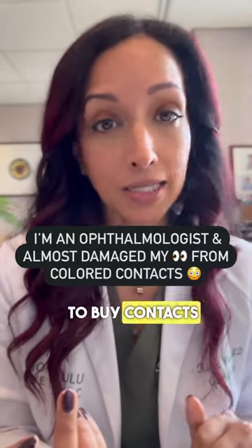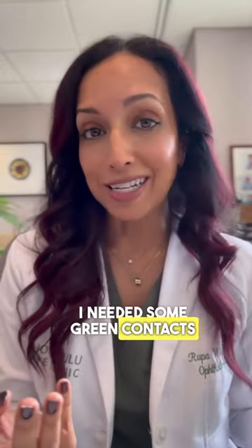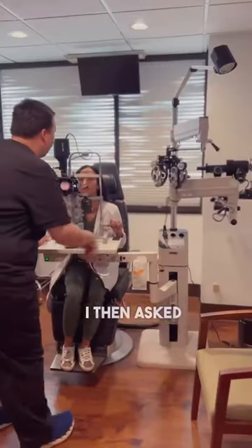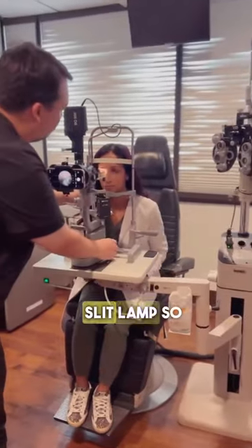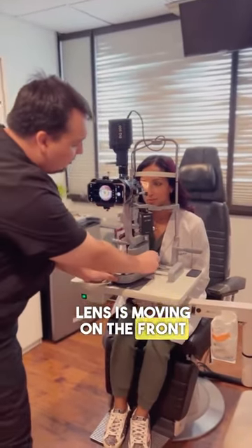This is why you never want to buy contacts online without a doctor's prescription. I needed some green contacts to do a video, and I knew that this was not going to be the right size for me. I then asked my head technician to take a video of me at the slit lamp so you could see how much this contact lens is moving on the front surface of my eye.